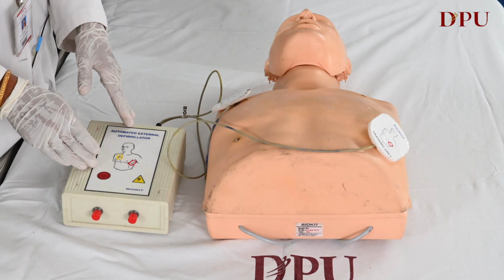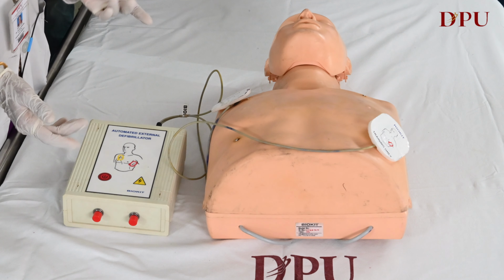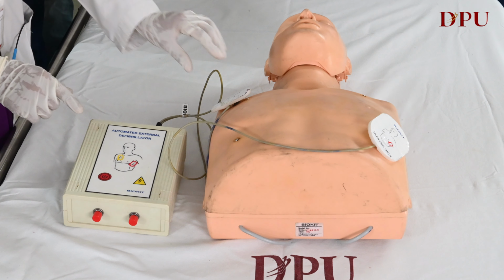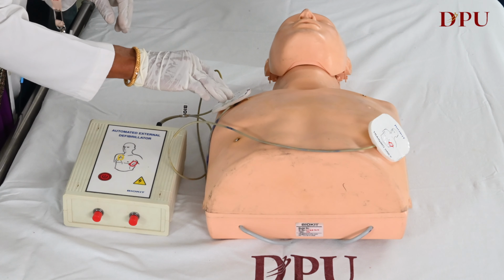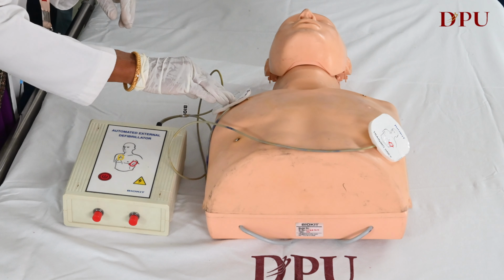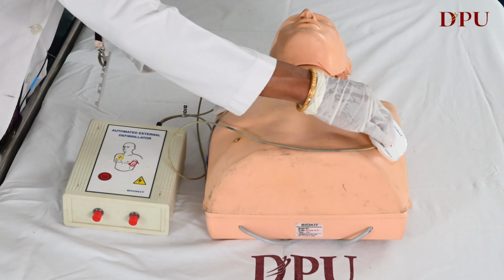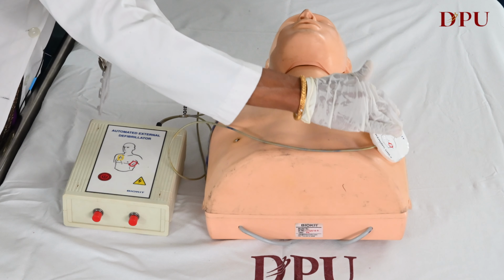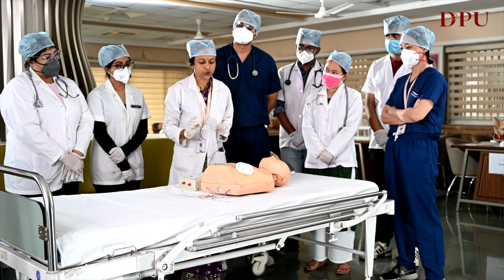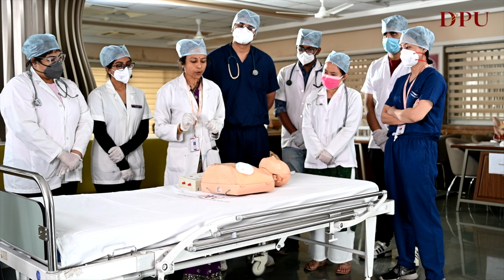When the AED arrives, step one is you put the power button on like any electronic gadget. Then we get 2 electrodes. One electrode goes in the right infraclavicular fossa, below the right clavicle. The other goes on the apex of the heart, so you can put it in the axillary line anywhere. Make sure that both electrodes are not touching. One is the functioning electrode, the other is the neutral electrode.